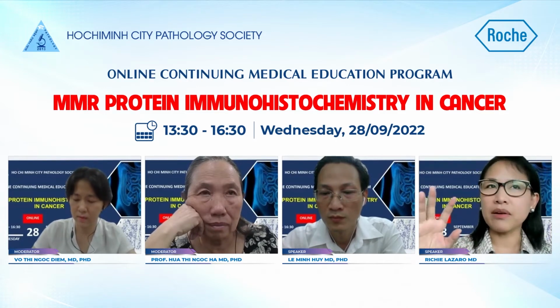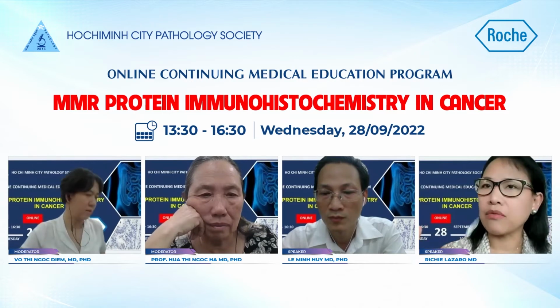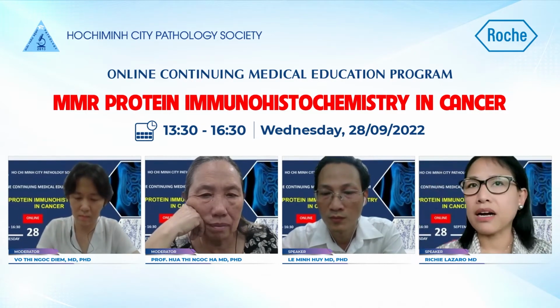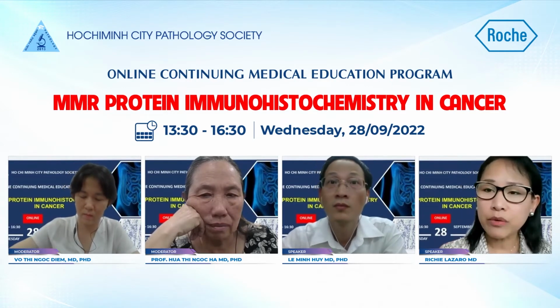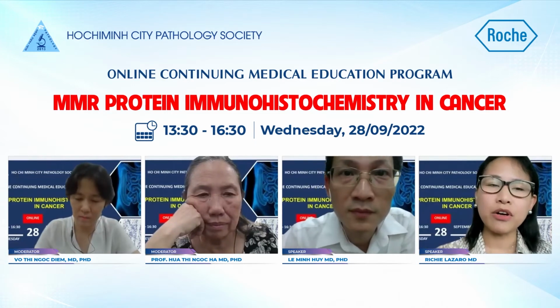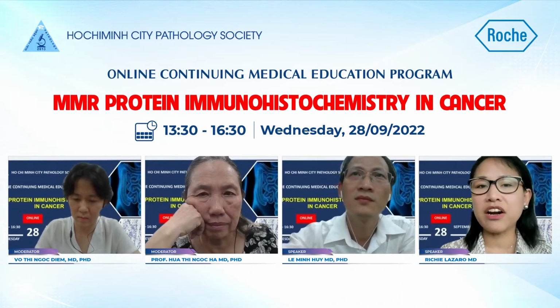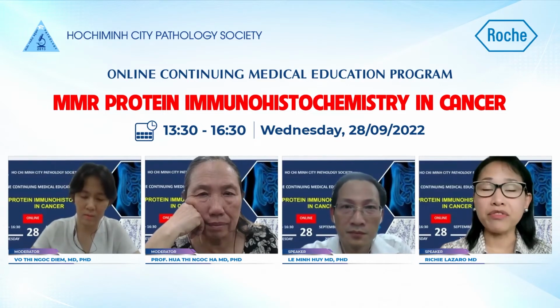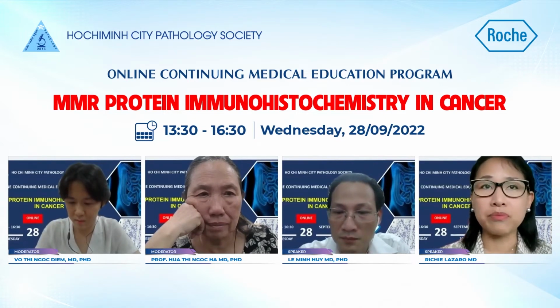So it could appear as focal staining, or maybe weak staining, or a bit of an equivocal staining. But it takes a lot of clinical correlation in this scenario, especially if Lynch syndrome is being suspected, or if there is a consideration to do immunotherapy.